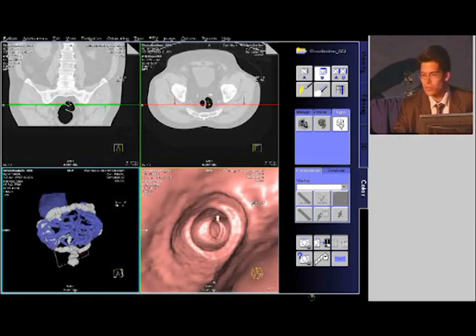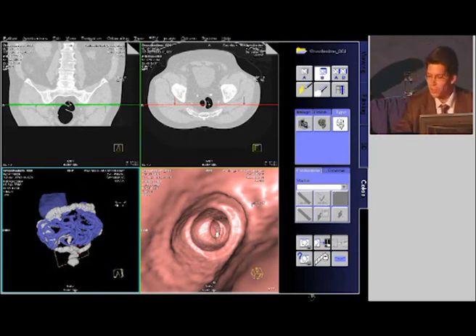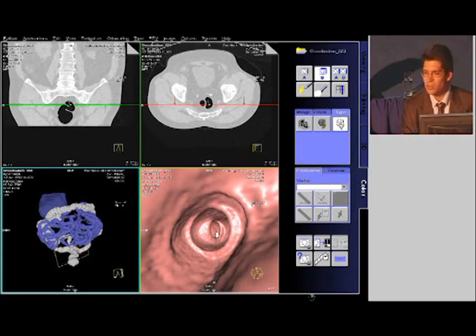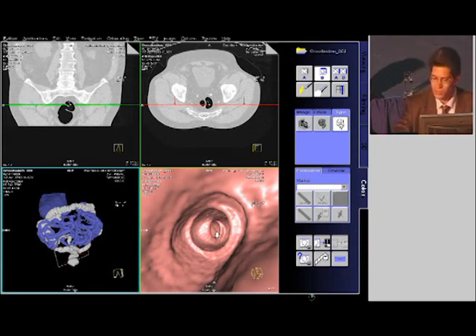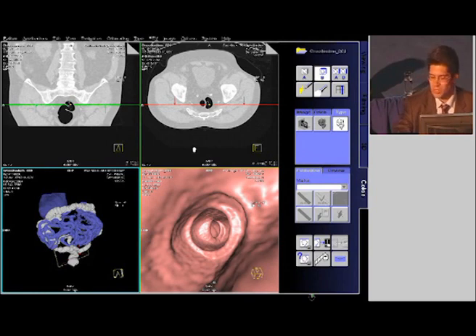There is still controversy about how to read a virtual colonoscopy. I just two weeks ago discussed with leading European experts in Belgium about how everybody does it. It's still split into those who do primary 2D and those who do primary 3D read. There are no clinical trials showing statistically significant differences between those two approaches, so everybody can do the approach they prefer personally. The nice thing about this software is that it's one of the few systems on the market you can equally use for primary 2D or primary 3D read.